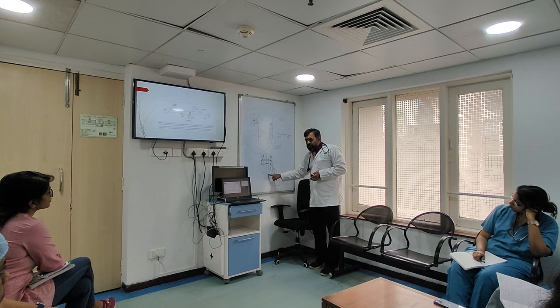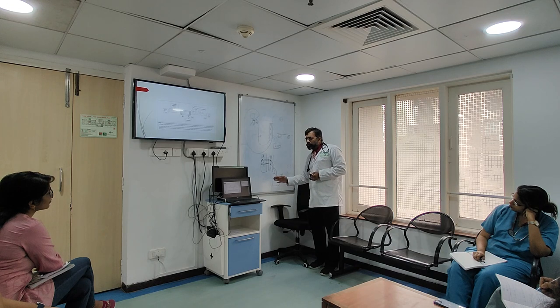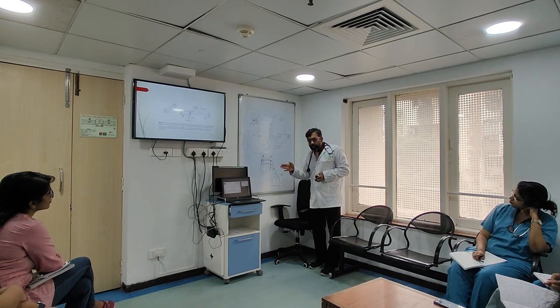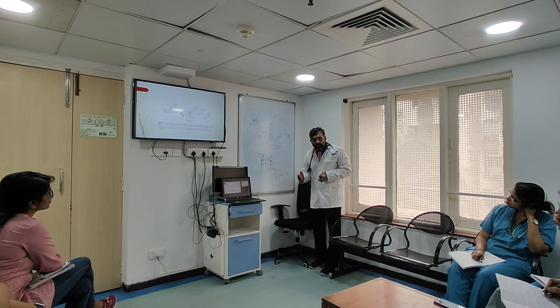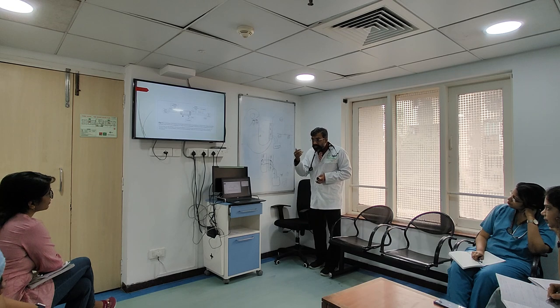When I say convection, what am I having? I'm having a filter. Am I giving dialysate fluid here? No. But I know that when I'm filtering out so much water and so many molecules, there is going to be a drop in blood pressure. So I need to give something more, some amount of water more. That water is called replacement fluid.